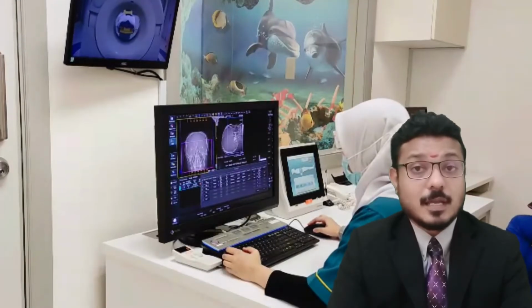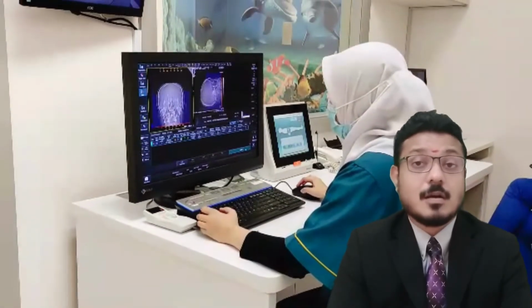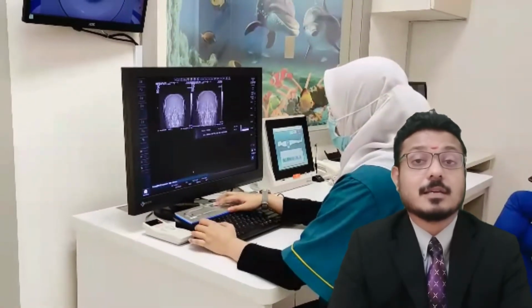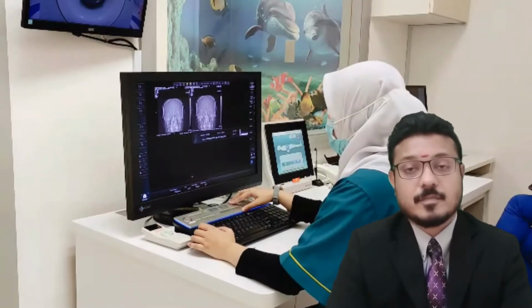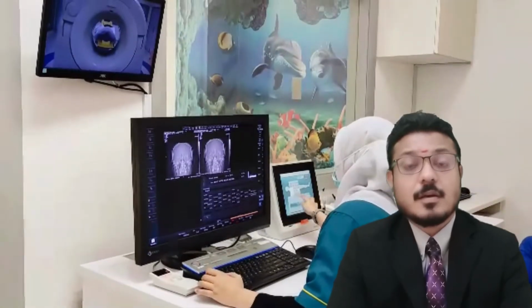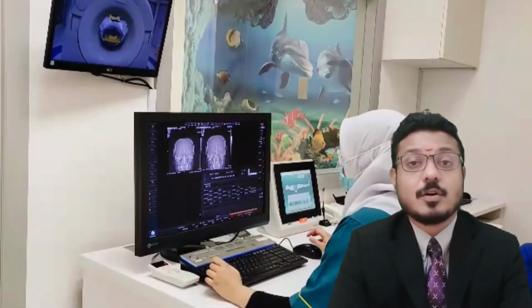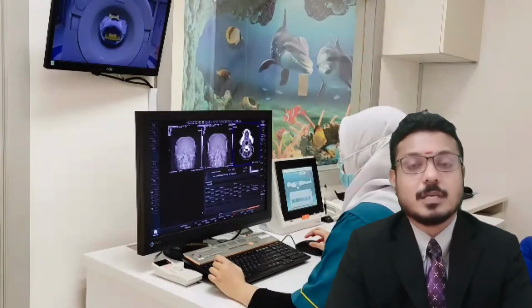During a CT scan, you will need to lie in a tunnel-like machine while the inside of the machine will rotate and take a series of X-rays from different angles. These pictures are then sent to a computer where they all will be combined to create images of slices or cross-sections of the body.